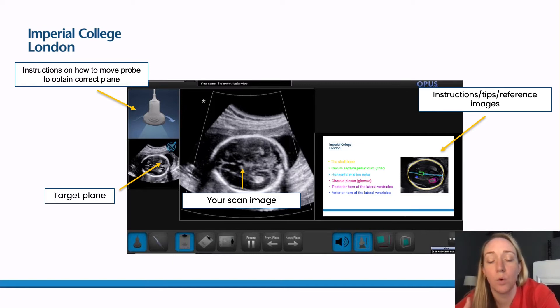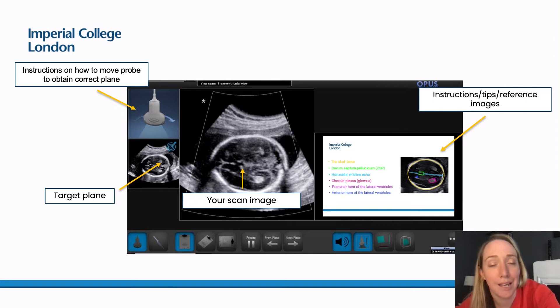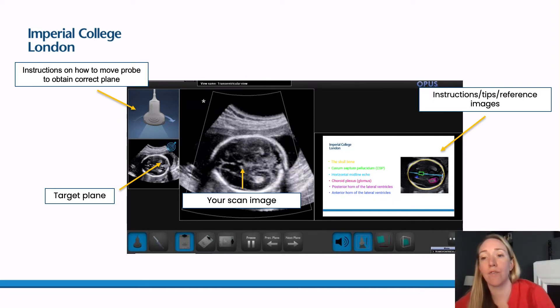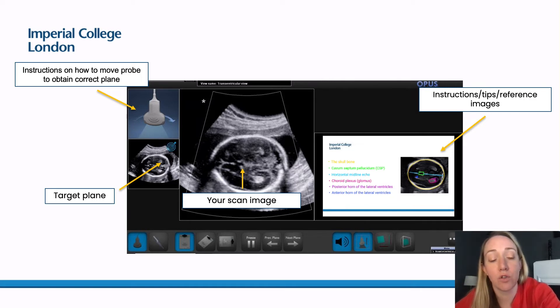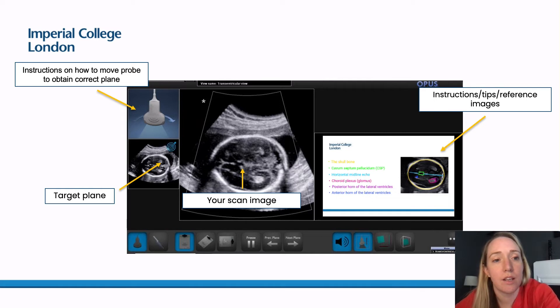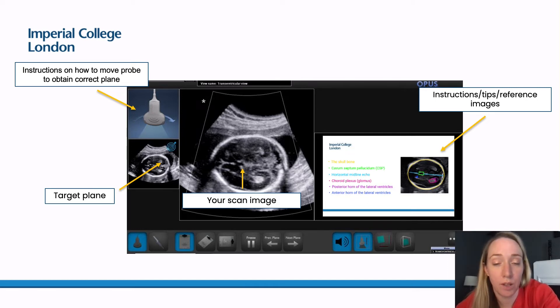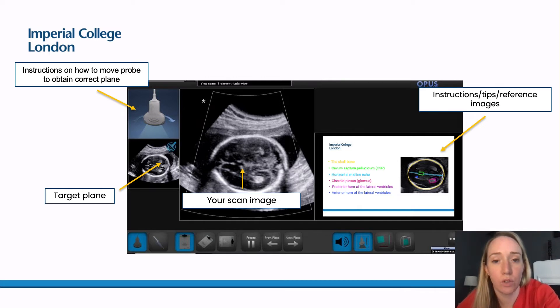When you open the modules, in the middle you have your scan image — the image the trainee is producing as they scan through the volume. On the right there's a box that may contain instructions, tips, reference images or videos. On the left-hand side the boxes are more optional. At the bottom, the trainee can view the target image — the target plane they are trying to achieve. At the top there's also the option for GPS guidance, showing the trainee which probe movements to make to move to the correct plane.